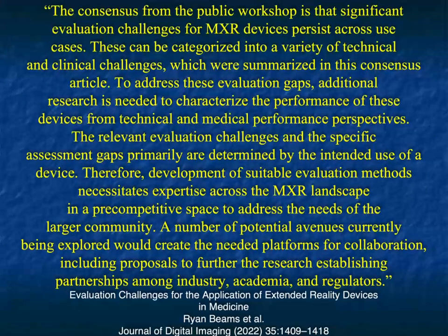In this article by Beams, the point is made that a number of potential avenues currently being explored would create the needed platforms for collaboration, including proposals to further the research, establishing partnerships among industry, academia, and regulators. Again, it is going to take time. We'll see what happens. I spoke in the beginning of this talk in part 1 about how long it's taken 3D to be moving along and still hasn't become routine practice.